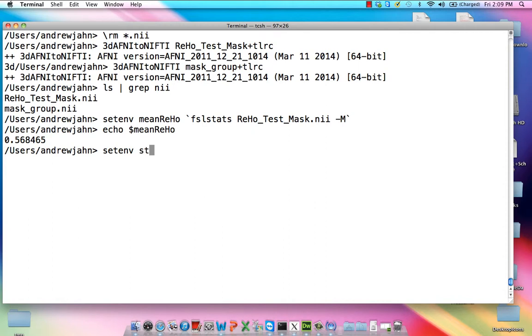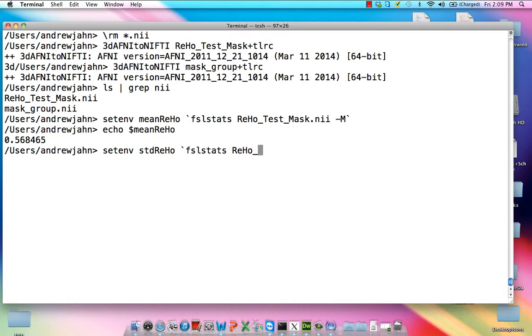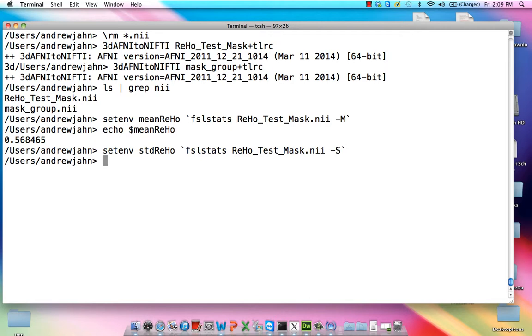I'm going to do a similar thing with standard deviation. I'm going to call this variable standard deviation Reho. Again, FSLStats, RehoTestMask. And a big capital S, which means only do this for non-zero voxels. Voxels which don't have a zero in them. In other words, only do the stuff within the whole brain mask.